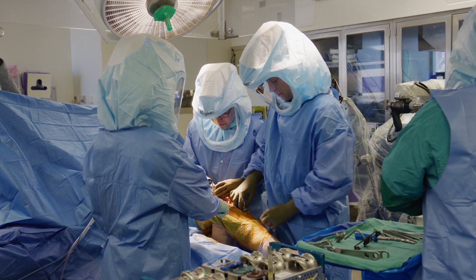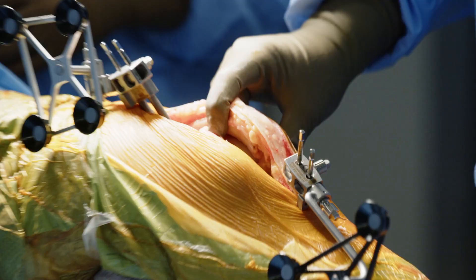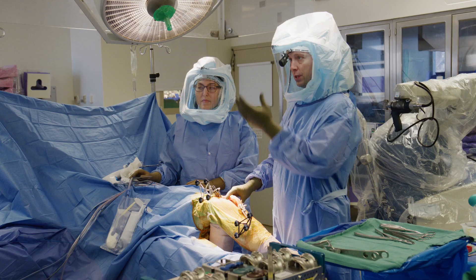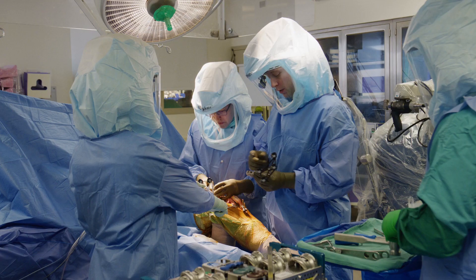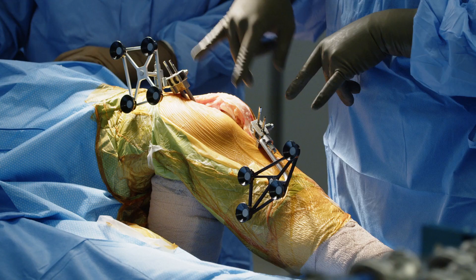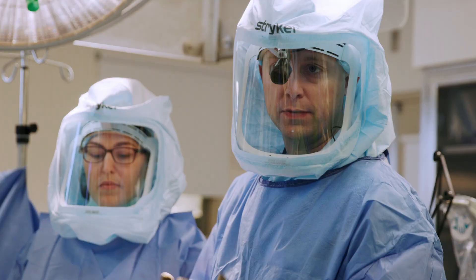This is the point in the case when we start to diverge a little bit from traditional total knee replacement. We already have a CAT scan of the knee, so we have a 3D model — we know what the knee looks like. This is our computer's eyes right here. It's an infrared system. These are the arrays; these are what the computer sees. I'll attach these to the knee so now it has something it can see — it can see these different points on the patient's knee. I'm going to give the computer some data so it knows where everything is in space, and then it can start feeding me information based on what we've gathered from the CAT scan.